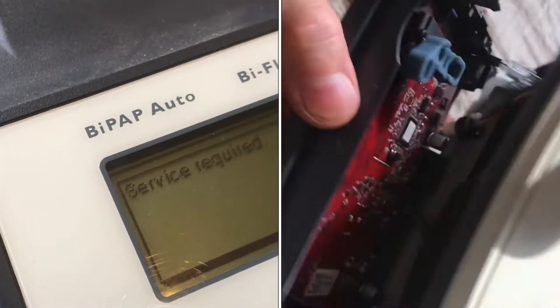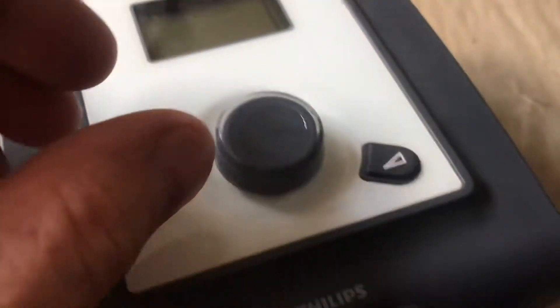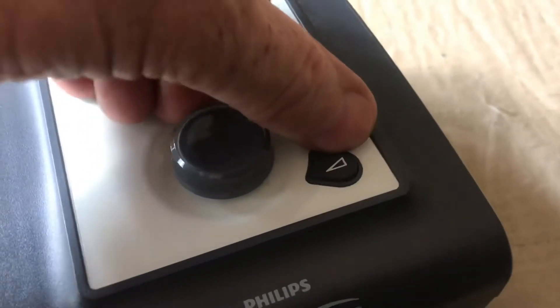If your CPAP machine says service required, I'll show you how to fix it. The screen will say service required, it'll be beeping, and this ramp light will be on.